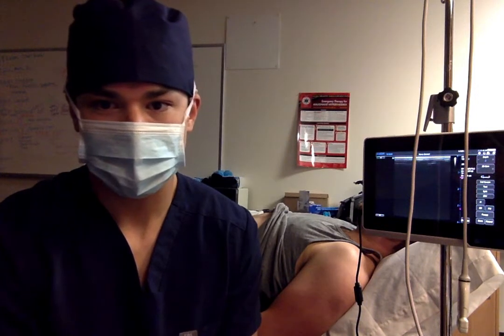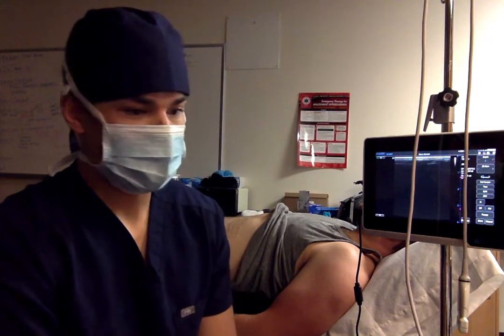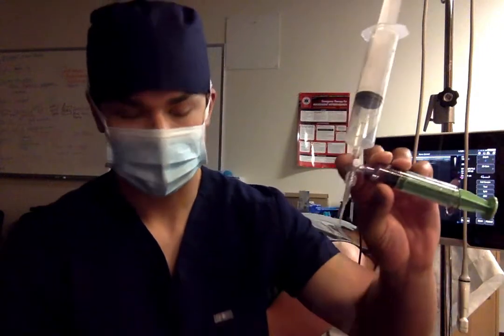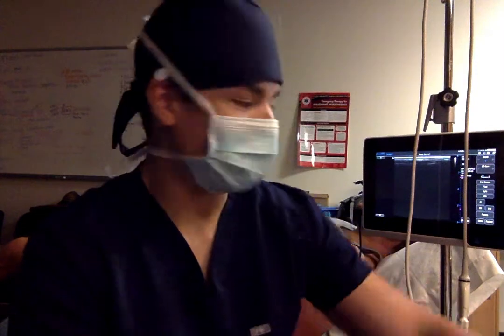If this is something you want to proceed with, we're going to get a consent form signed. Okay, we did that, so I'm going to gather all my supplies. I'm going to grab 2 syringes with stopcock. I'm going to grab my 22 gauge Stimuplex needle, my normal saline to hydrodissect.